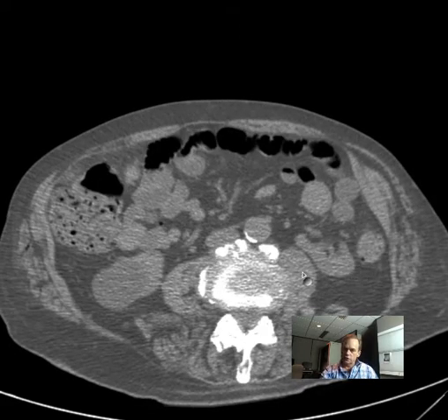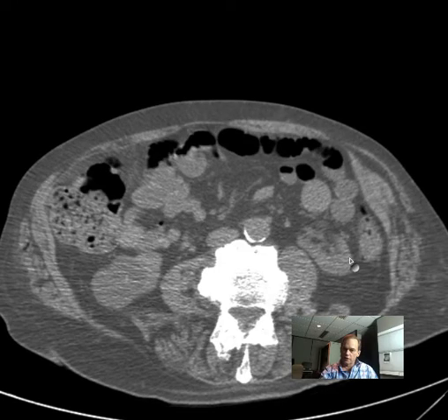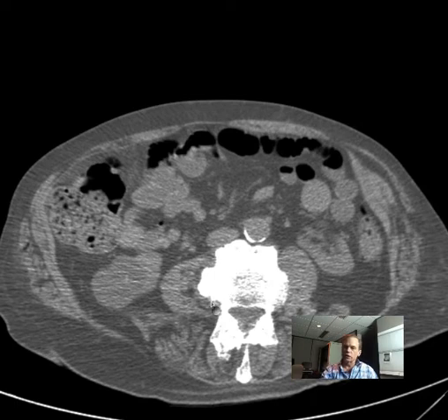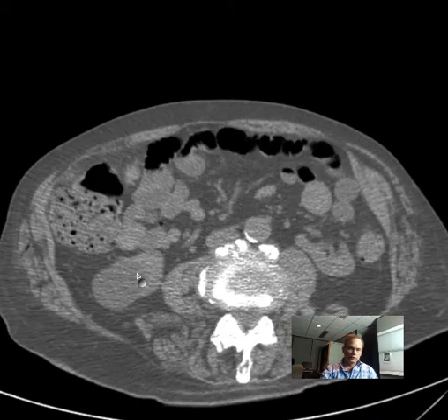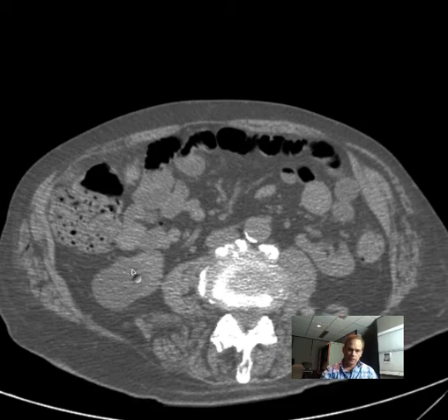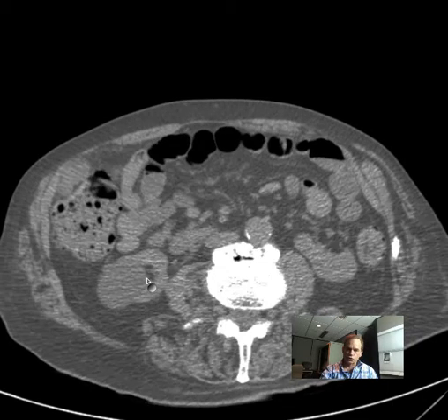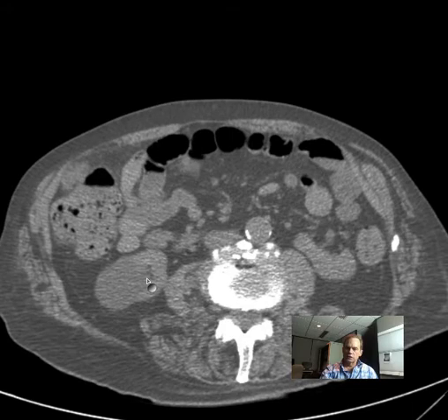Here you see a psoas muscle. They can look a little bit like one another, but the psoas is hugging very tightly to the vertebral bodies, whereas the kidney is in the actual retroperitoneal compartment. Something is going on with this right kidney — there's a cystic mass of some sort.